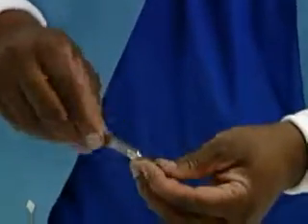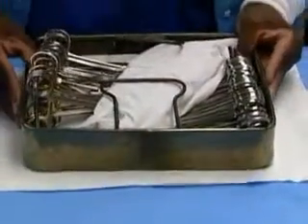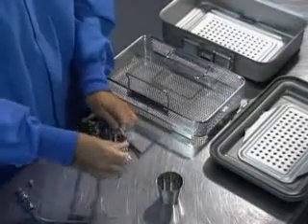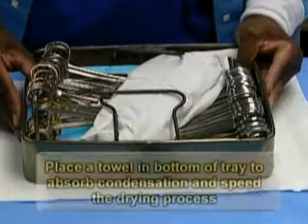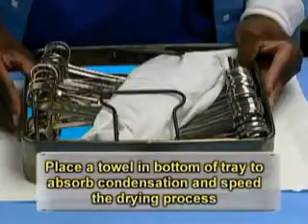An important step in the packaging phase is the inspection of each item and the packaging materials. To be effective, the sterilizing agent must come in contact with all surfaces of every instrument. Instruments should be arranged in sets and placed in a tray with a mesh or perforated bottom or specifically designed container that permits the penetration of the sterilizing agents and prevents trapping of air. A towel or other absorbent material may be placed in the bottom of the tray to help absorb condensation that is formed during sterilization and help speed the drying process.